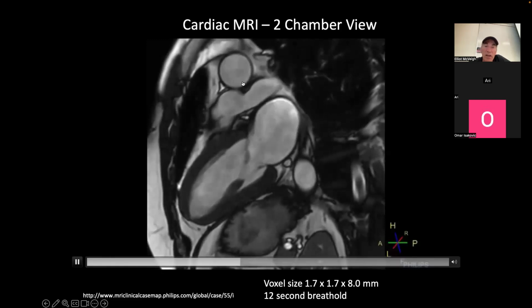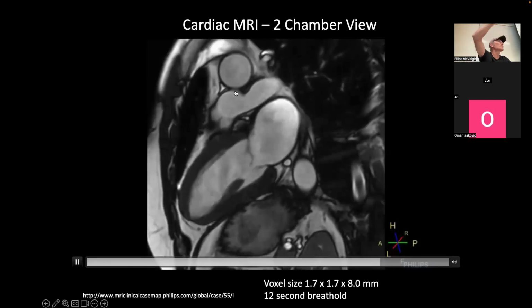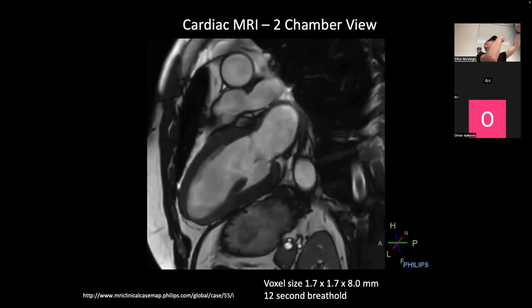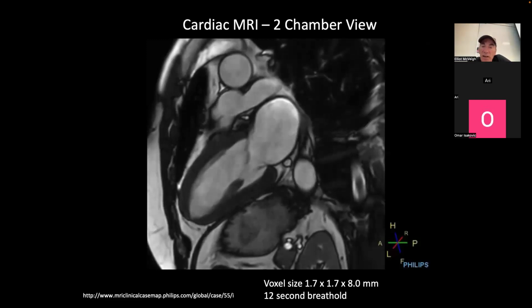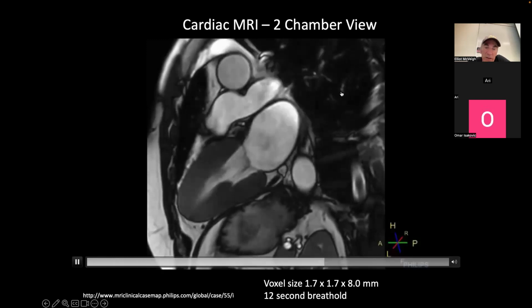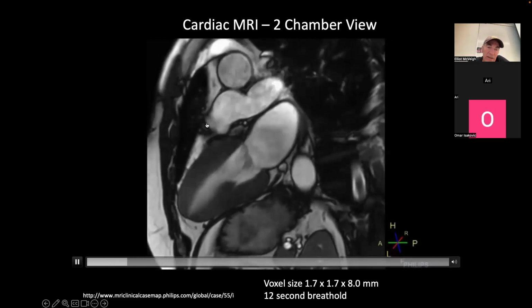That is the aorta. And what's interesting here is you can see that there's also a circular flow, like a vortex of flow. And when the blood goes into the aorta and it makes the turn, there's this constant vortex of flow as it goes around there. What else is interesting here? Oh, there's blood flow in the vessels in the lung field. Here's some very bright vessels. And all of this white signal here is interstitial fat, right? And this stuff here.